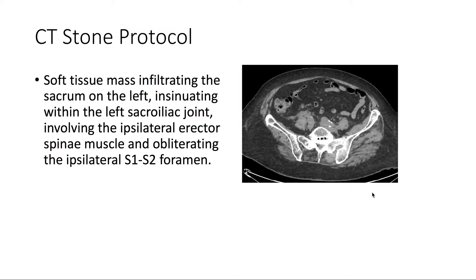There's also a soft tissue mass infiltrating the sacrum on the left. It's within the left sacroiliac joint, involving the ipsilateral erector spinae muscle. At the level of S1-S2, it obliterates the foramen.